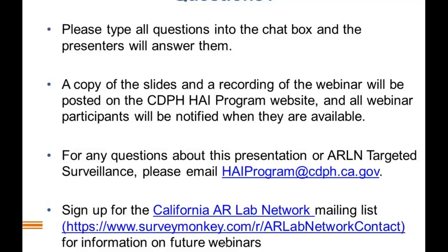As far as antifungal susceptibility testing on all Candida species that are submitted to them, that has a little more of a turnaround time. Previously they were sending it out; now they have the capability on site to do it, but I think it still takes a little bit of time. So if people are asking about a clinically relevant turnaround time for antifungal susceptibility testing, that could be pushing it a little bit, but we're mainly talking about within 24 to 72 hours. For colonization screening, that occurs pretty rapidly, usually within 24 to 48 hours.